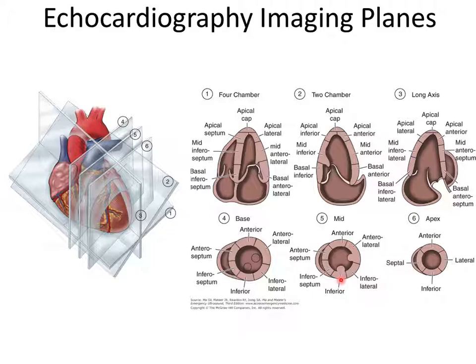So when they say, oh, there's low flow, and their colleague says, where is the low flow? They will name one of these chunks, right? So you have basal, mid, and apical, and then in the clock face direction, you have these 6 chunks, right?